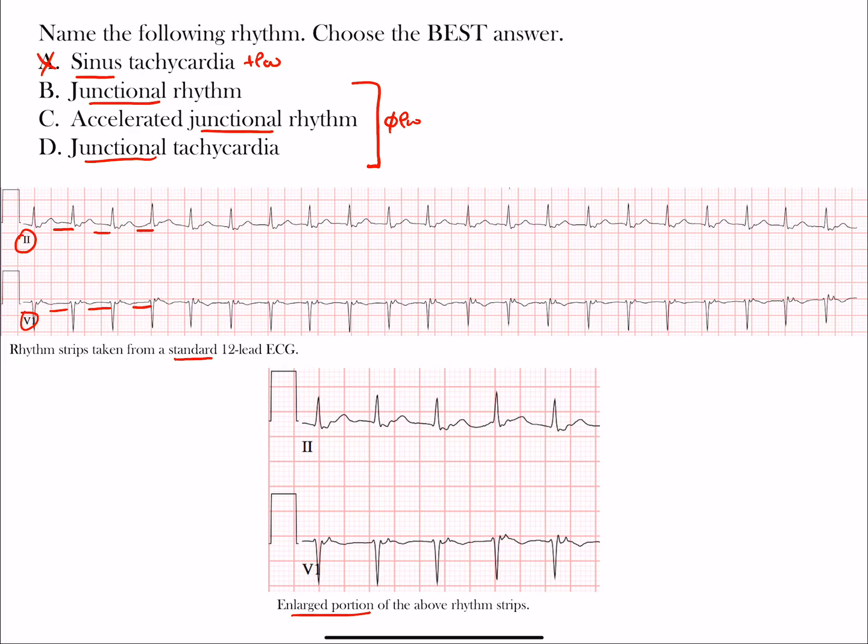That should automatically tell you this is not a sinus rhythm. P waves should precede the QRS complex. For our case here, sinus tachycardia is not the best choice, so it's got to be one of the other choices.